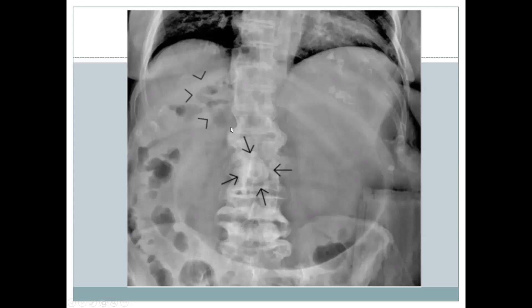It should be noted that Rigler's triad is observed in its complete manifestation in only 36% of cases. This limited sensitivity is due to obesity, superimposed bony structures, or fluid-filled bowel obscuring the gallstone. Furthermore, only 20% of gallstones contain enough calcium to be identifiable on plain radiograph, as they are mostly composed of cholesterol. Pneumobilia may also result from prior surgical or endoscopic biliary manipulation, so the clinical picture should be taken into consideration.